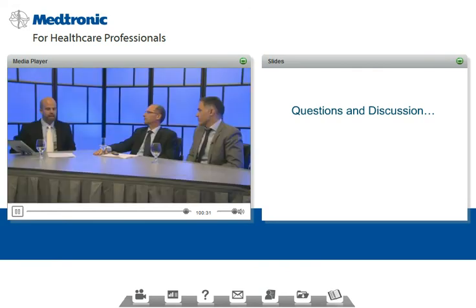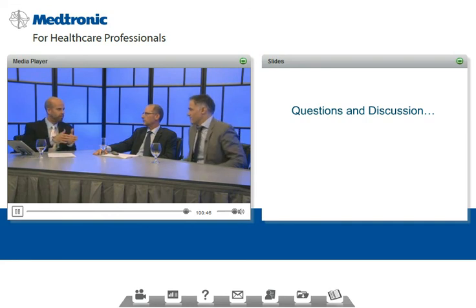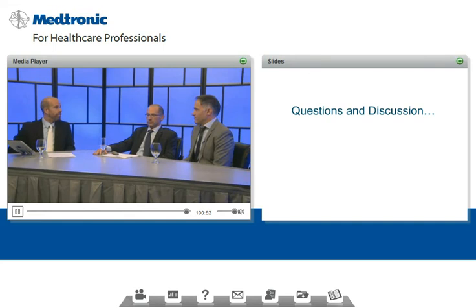Excellent. Thank you. And the final question is one that's come up a little bit in recent history about the active insulin time. Historically it's probably been set at 4 hours for the most part. I'm wondering whether either of you might suggest setting it a little bit shorter or a little bit longer. I know that some healthcare practitioners are now setting it at 5 hours instead of 4, and whether that might make a difference. So I'll give you my take on this.